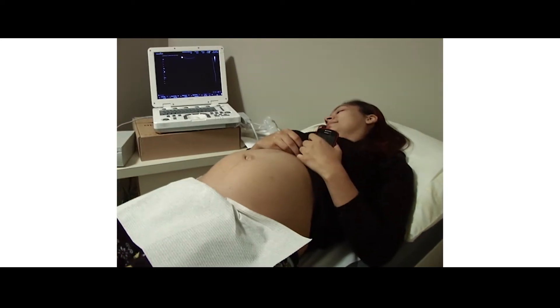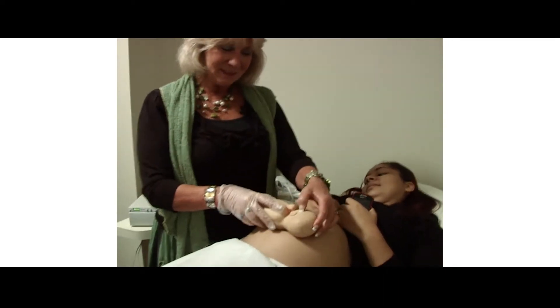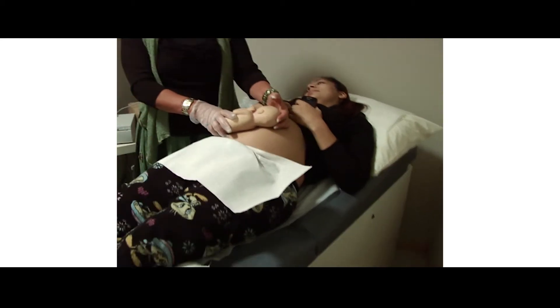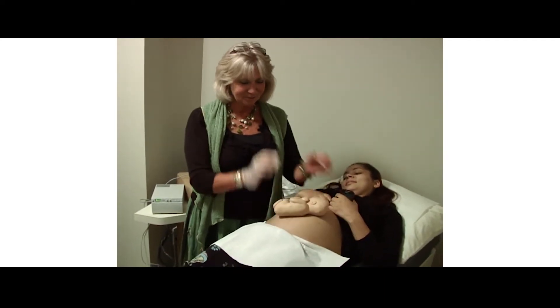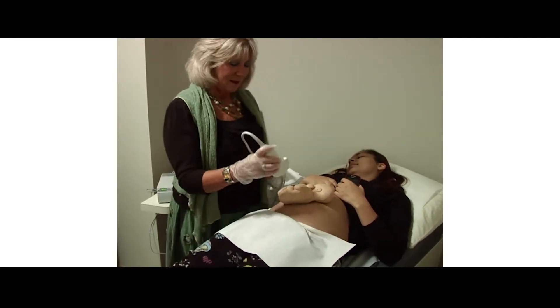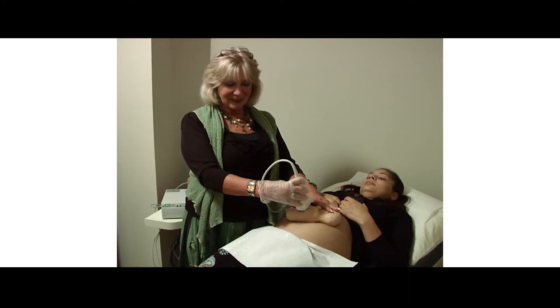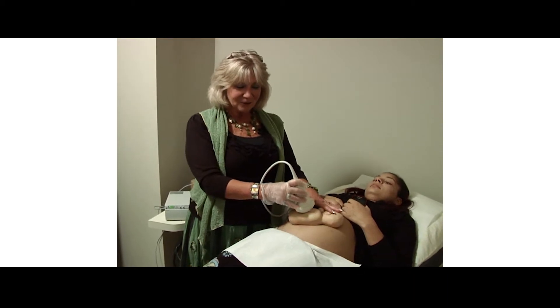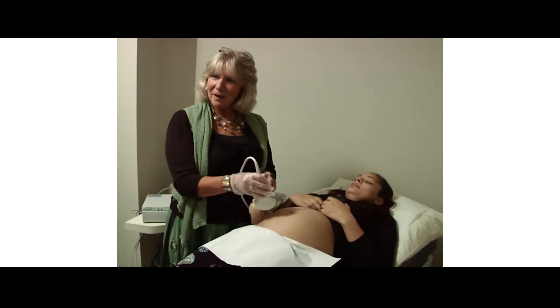This baby is a little bit bigger than your baby — this one is about 24 weeks. These babies can lie anywhere in mom's tummy, so once we're done with mom we're going to concentrate on finding that baby's lie. So let's say the baby's lying like this inside a mom — you take your transducer, go find any part of baby. If this is sagittal and the baby was lying like this, we'd be getting the baby cross-sectionally during the abdomen area. Then you just slowly rock and turn until you connect the head bone to the backbone — that's the fetal lie of the baby.